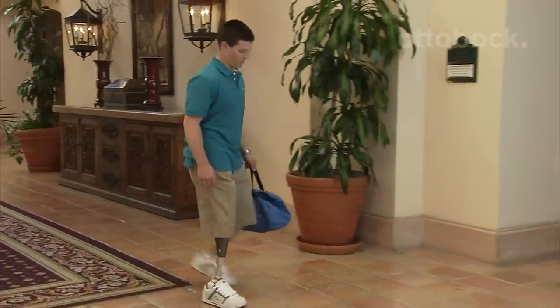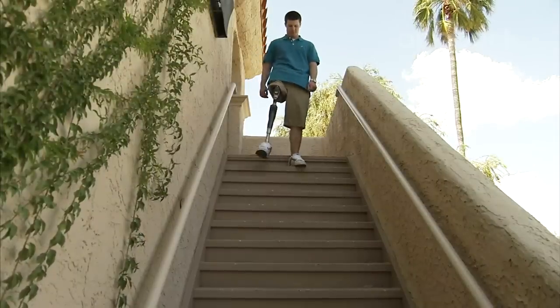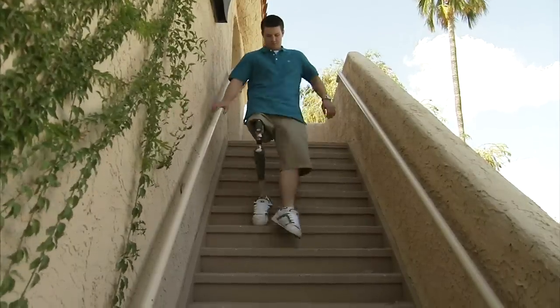Stairs is such a huge part. Some amputees just hate stairs — they look at them and are just scared of them. If you're looking at the Helix, what does it offer me? Stairs.